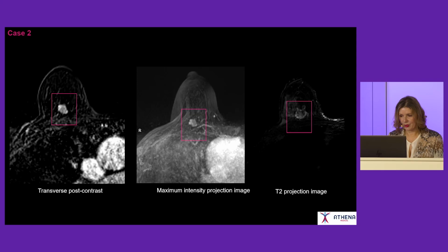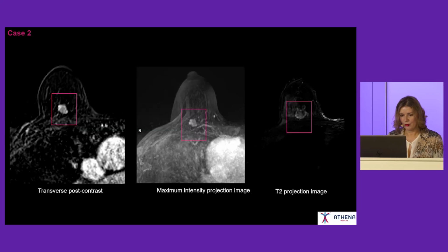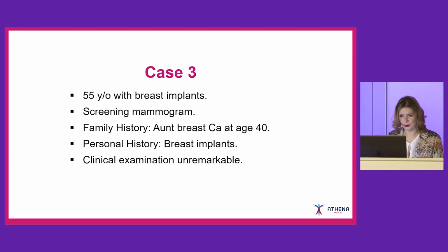The correlate images of her MRI examination performed the same day, and the biopsy, this was an invasive lobular cancer measuring 1.13 centimeter. Although it was superficial, because I also performed handheld to this patient, it was not palpable, and the lesion on biopsy was extremely soft.